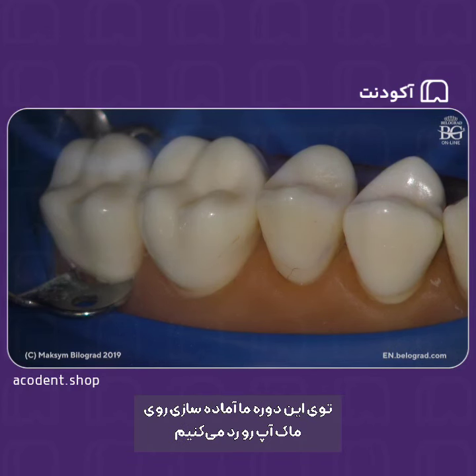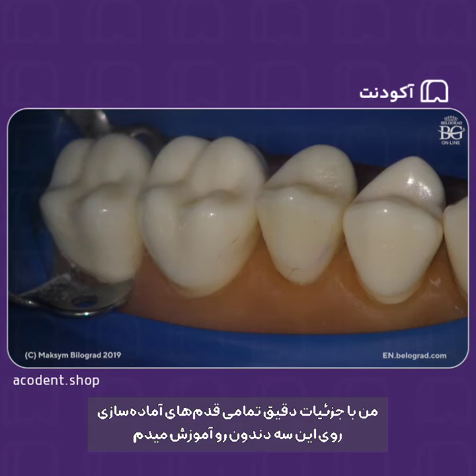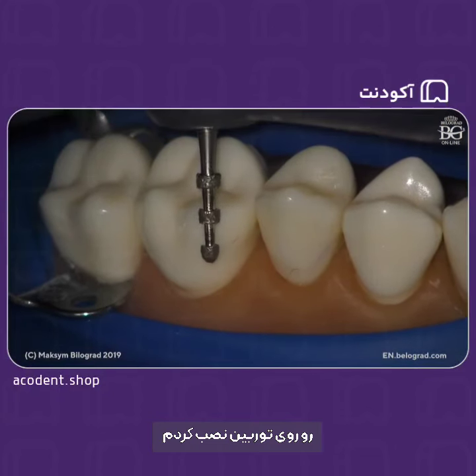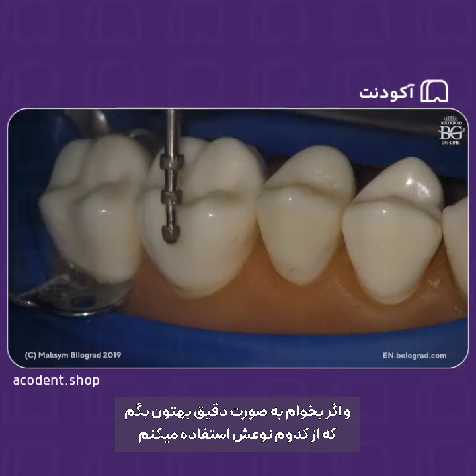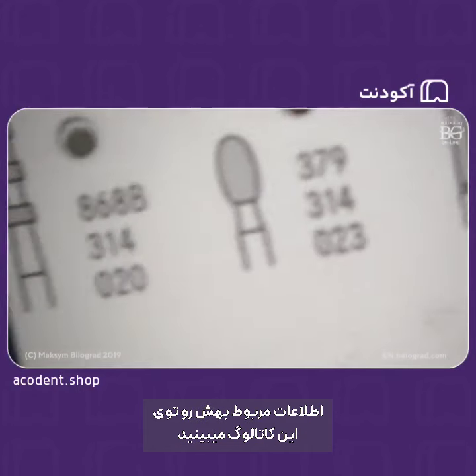In this masterclass we will skip the mock-up, we will just prep teeth through their own structures here, and I will show you in very precise detail all steps of these preparations for all three teeth. We have already inserted the depth cutter. This depth cutter that I'm using is from our burr set, and let me give you a reference number of this burr.